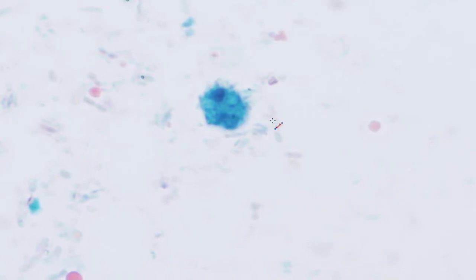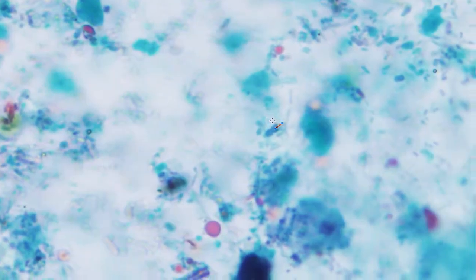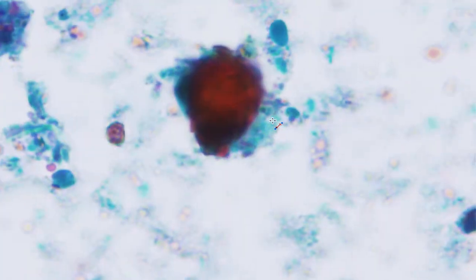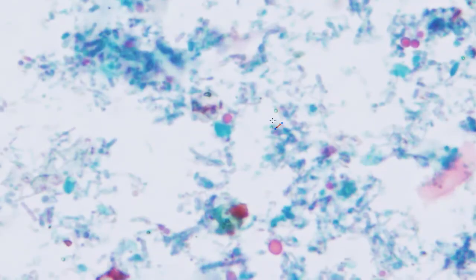That's not normal. Remember that I told you that Entamoeba histolytica is 12 to 15, and really the lowest it tends to go in size is 10. So this looks a bit like an Entamoeba histolytica, or even a bit funny, but it's too small to be Entamoeba histolytica. Those of you who are connoisseurs of the Entamoeba will know that this is actually an Entamoeba hartmanni. Morphologically almost identical to Entamoeba histolytica, though they do ingest bacteria sometimes, but smaller.